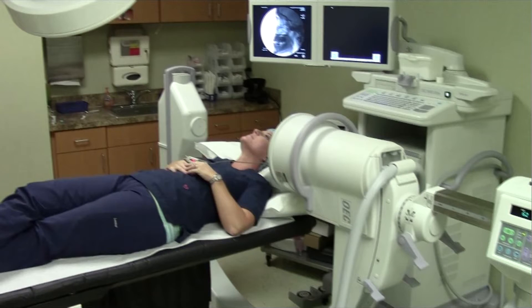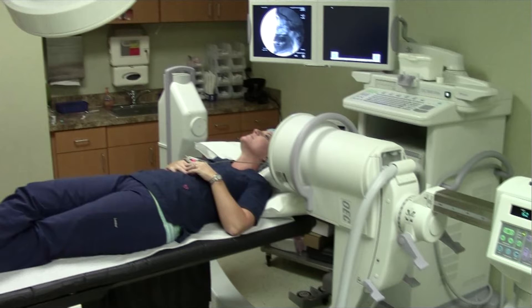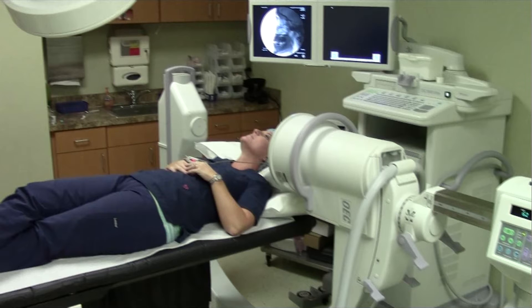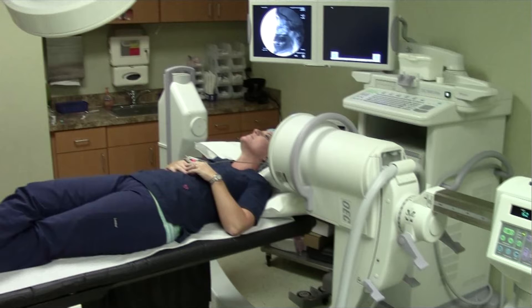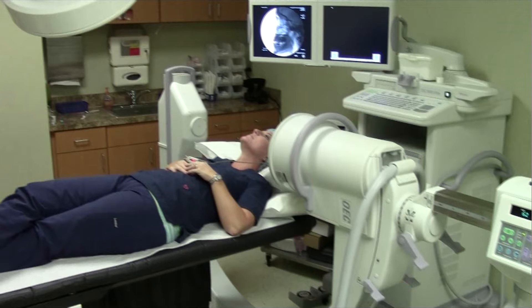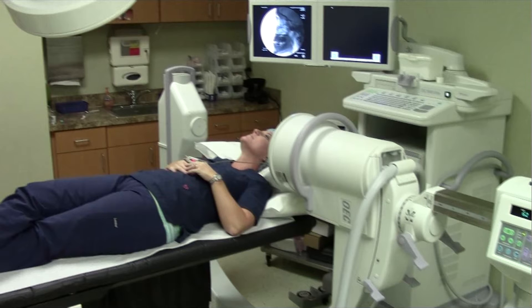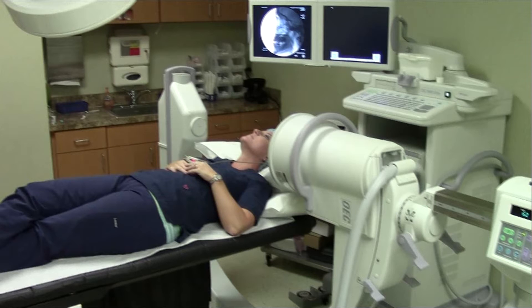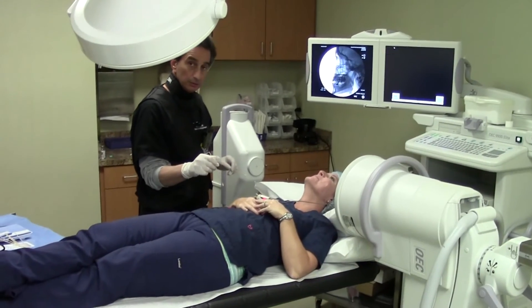This is a 38-year-old female who has a 10-year history of chronic recurrent migraine headaches. She has had very limited success with multiple treatments, including a number of medication trials. She is actually here for repeat treatment, as she had her initial sphenopalatine ganglion block approximately six months ago, and her headaches are just beginning to return.